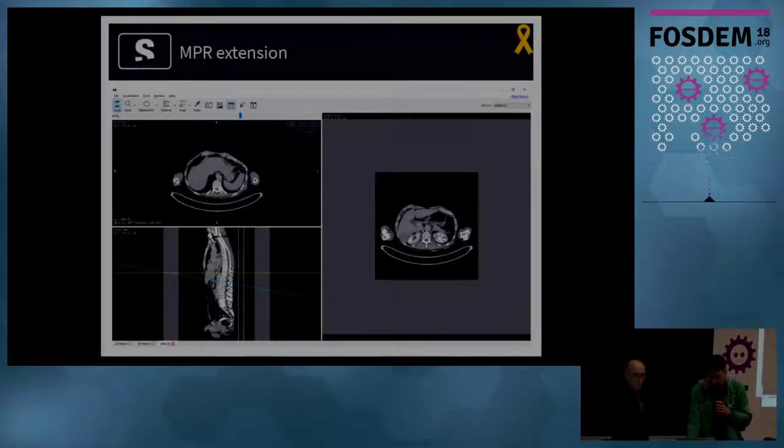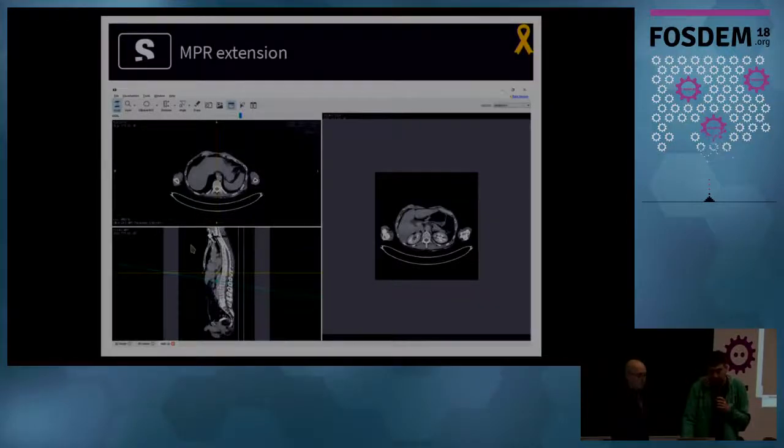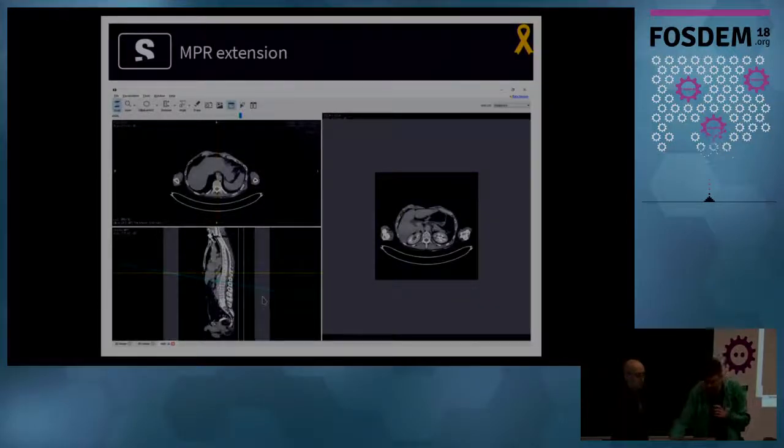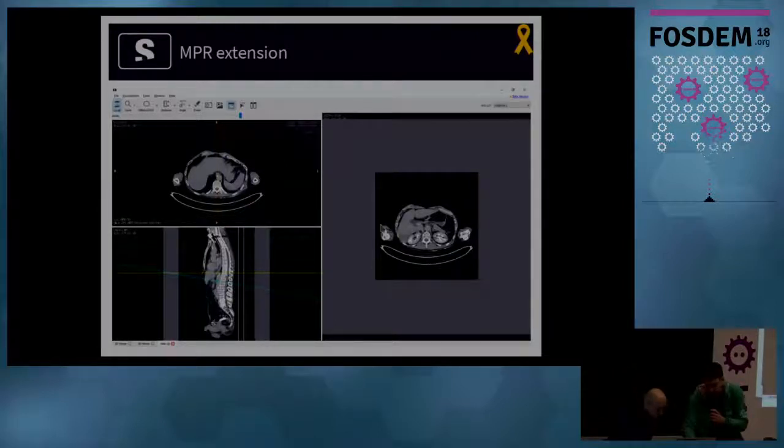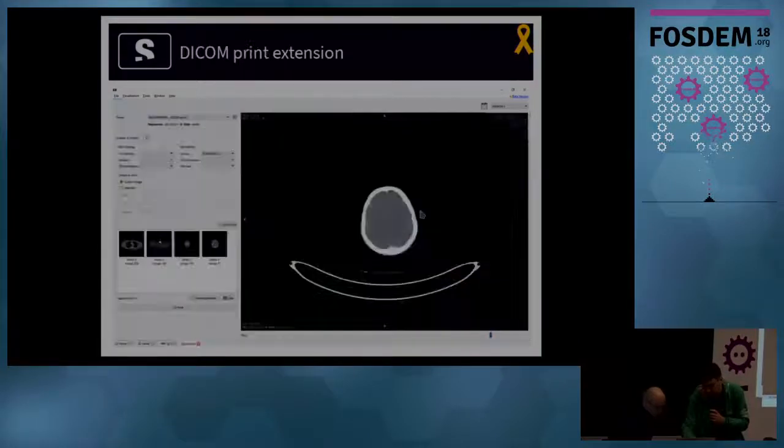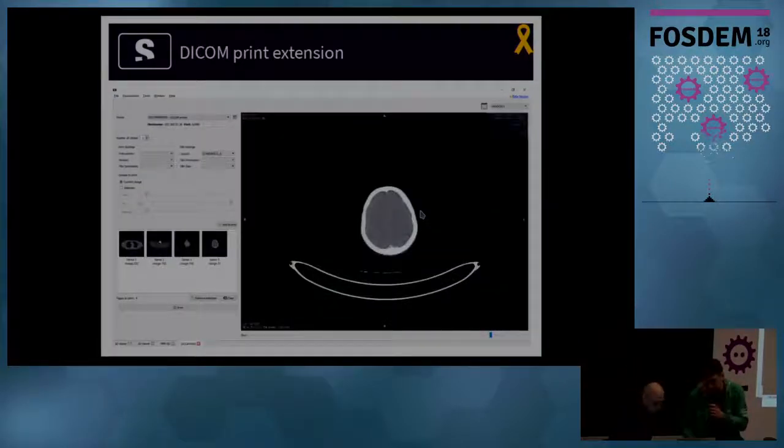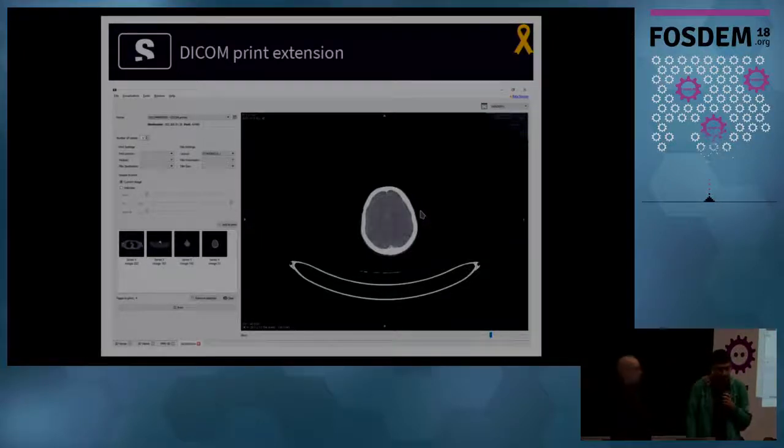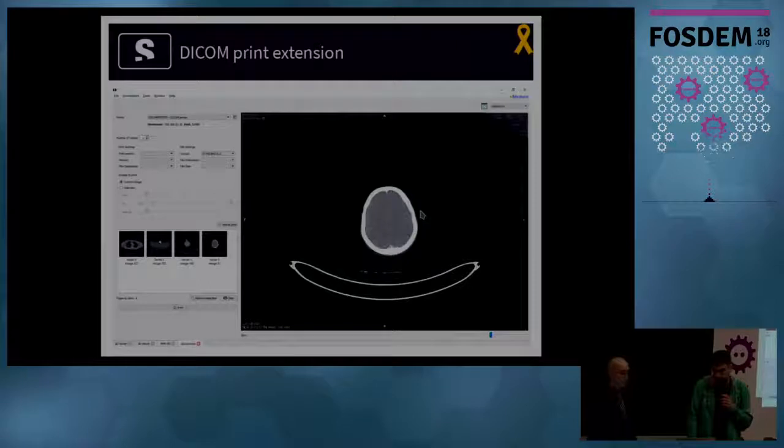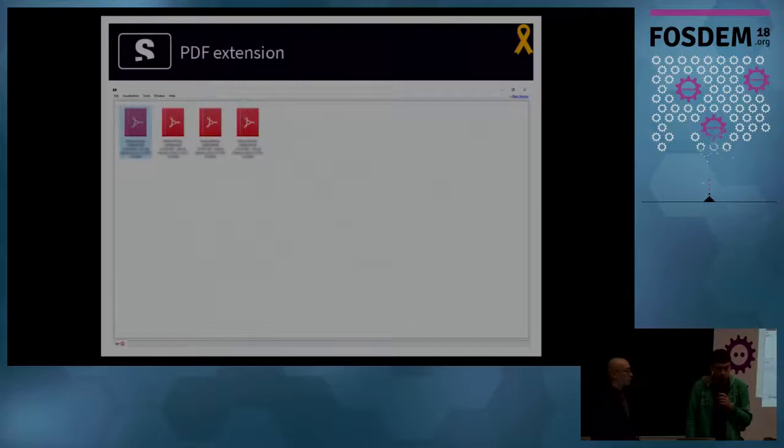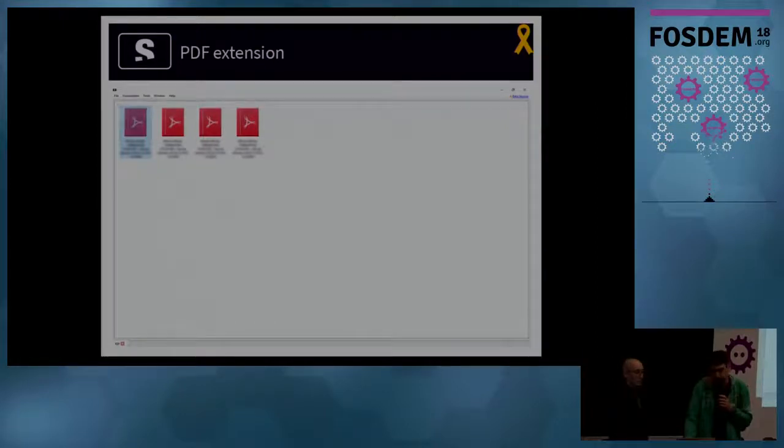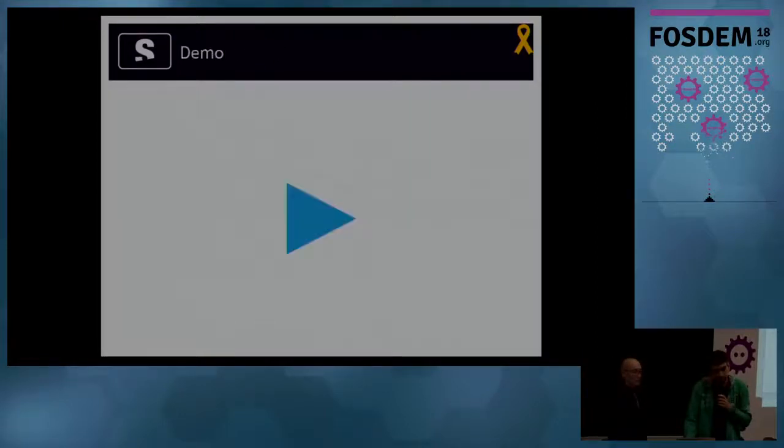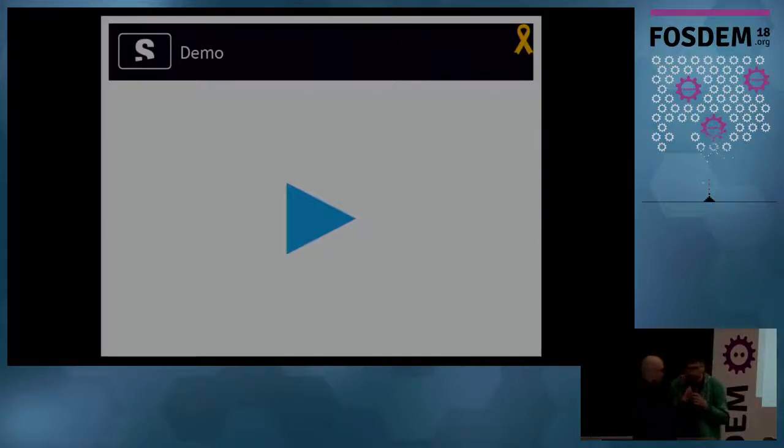The multi-planar reconstruction extension allows you to see images in two dimensions, but in a non-orthogonal plane. For example, here there is an oblique plane, which is aligned with a vertebra, which allows you to see the disk of the vertebra. Then we have the DICOM print extension, which allows you to send an image to a DICOM printer to have it in a film, like in the old days. And finally, a PDF extension, which leaves the encapsulated PDFs in a study and lets you open them in the default PDF viewer. And now, Adria will show you a demonstration.